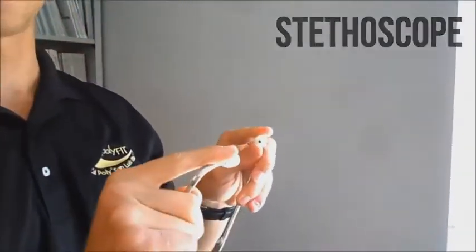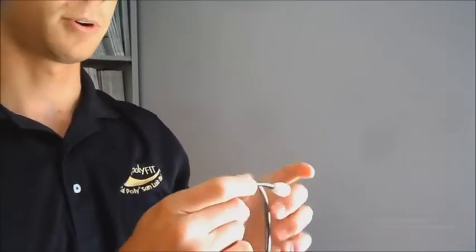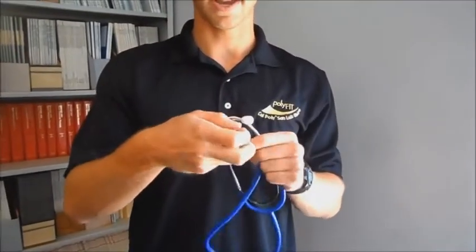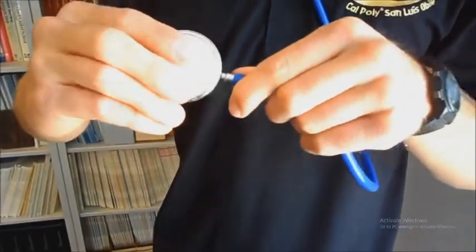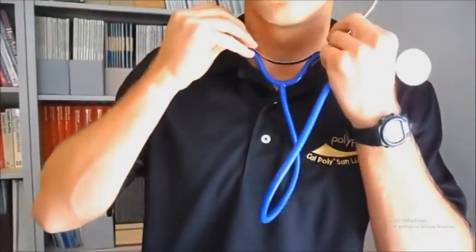When you put it in your ears, make sure that these prongs are facing forward, not backwards. Even though that's what you think it should be, you face it forward. And double check to make sure it's on by twisting. You can twist this and tap on it. Right now it's not really making a noise in my ear, but when I twist it, then I can hear it. That's how you know if your stethoscope is on and working. Otherwise, you might be sitting there thinking this person has no pulse, when really your stethoscope is just turned off.